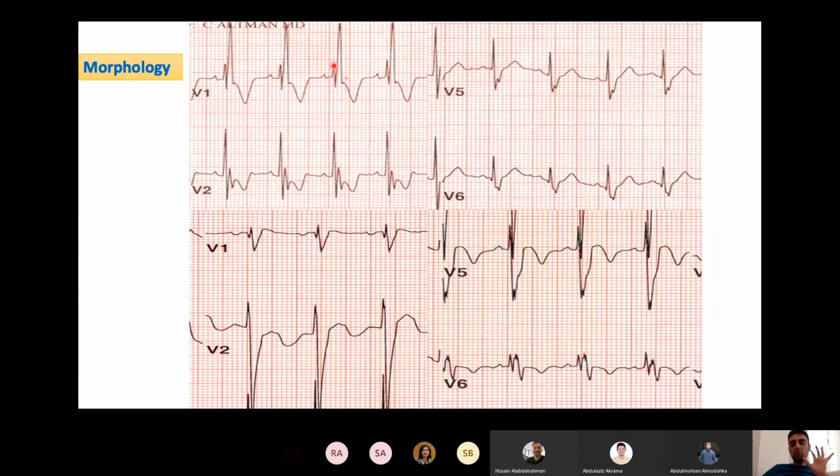And then the activation travels down the septum all the way to the apex and the left ventricle. Because you have right bundle branch disease, you will get left-sided activation unopposed. Usually they are activated at roughly the same time, but now because only your right bundle is diseased, you'll get unopposed left-sided activation and you'll get an S wave in V1.